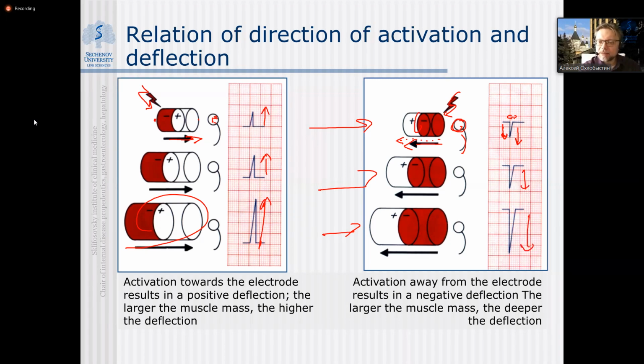We'll have the same amplitude. The measurements will be absolutely similar, just in a different direction. What will change will be the sign of deflection. For instance, instead of the direction rightward, it will go leftward, or instead of up, it will go down.